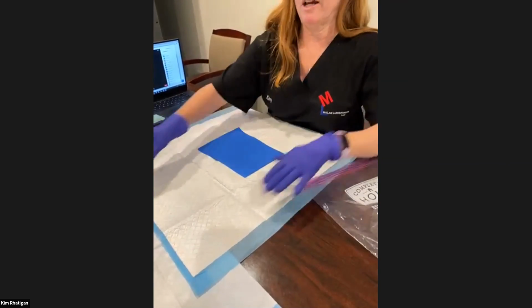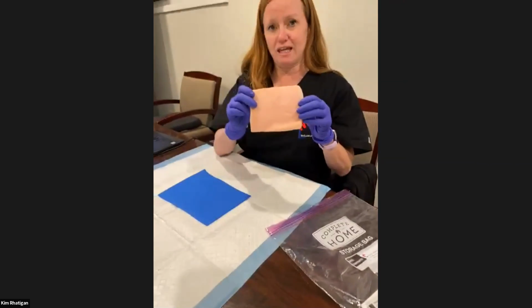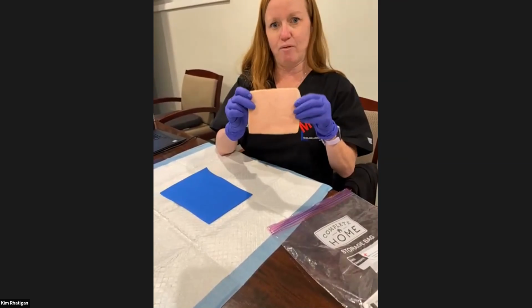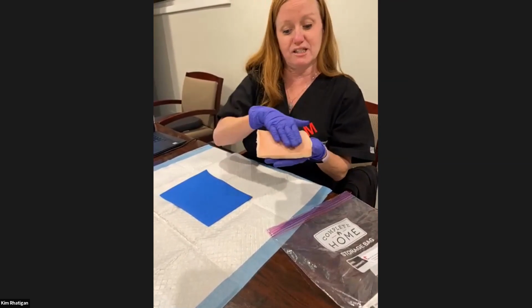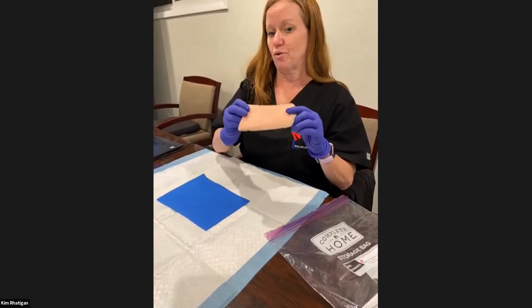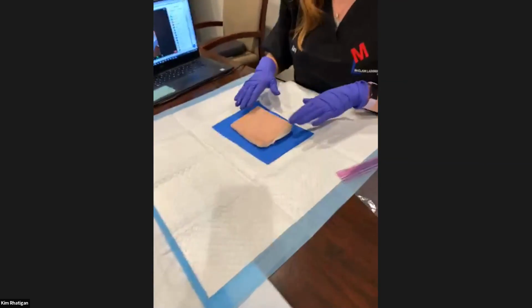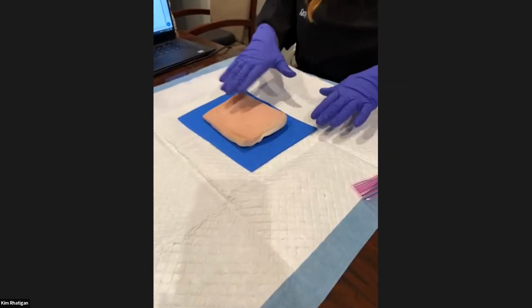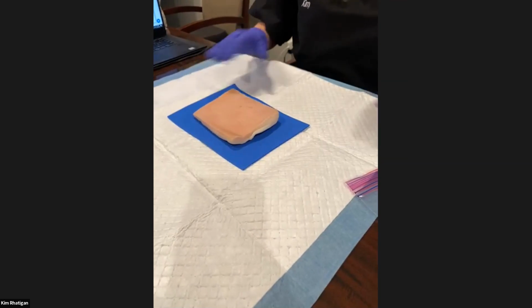Now, at this point, I hope you have opened up your pig skin, taken it out of the plastic, and washed it in the sink to remove all the salt. So I have a nice clean surface. It's dry and ready for action. I'll give you a moment to get out your stuff. There's the pig skin, clean, dry, ready to go, on top of the blue foam, on top of the chuck.